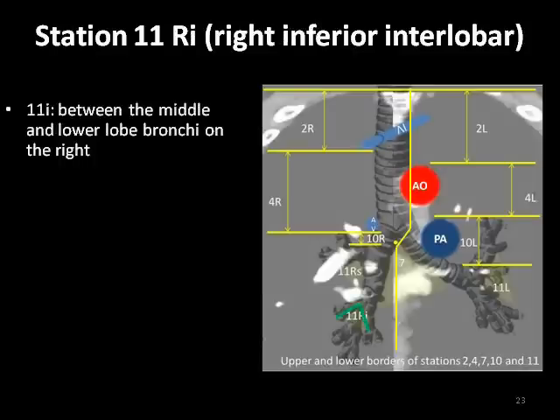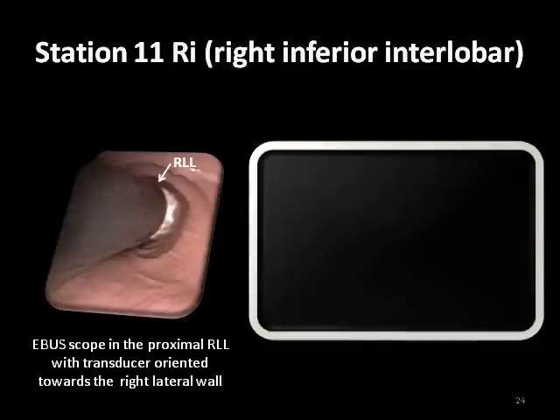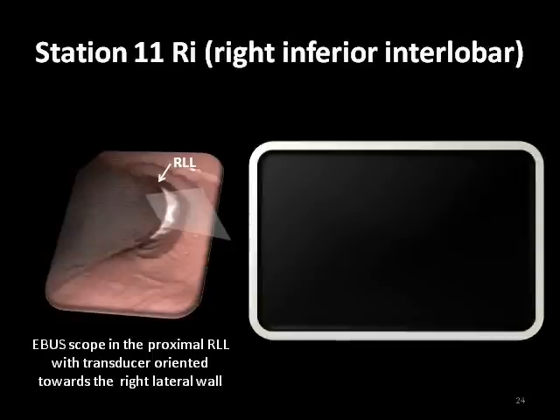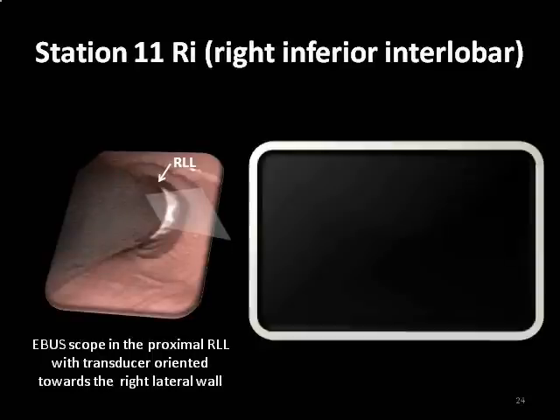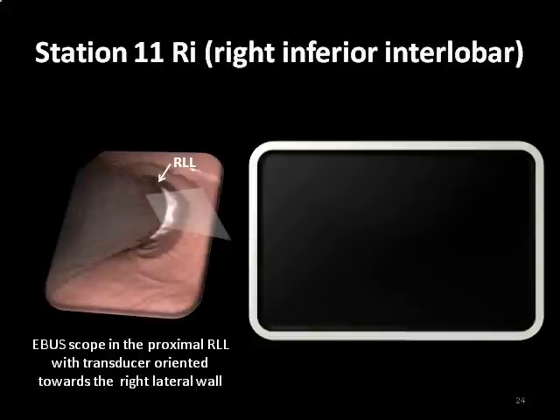Station 11R, inferior, is between the middle lobe and right lower lobe bronchi. To visualize Station 11R inferior, the EBUS scope is positioned in the proximal right lower lobe bronchus. In general, the transducer can be oriented towards the right lateral wall. Here, the lymph node and lung parenchyma are visualized. Again, interlobar vessels can be seen depending on the exact position of the node and scanning orientation.